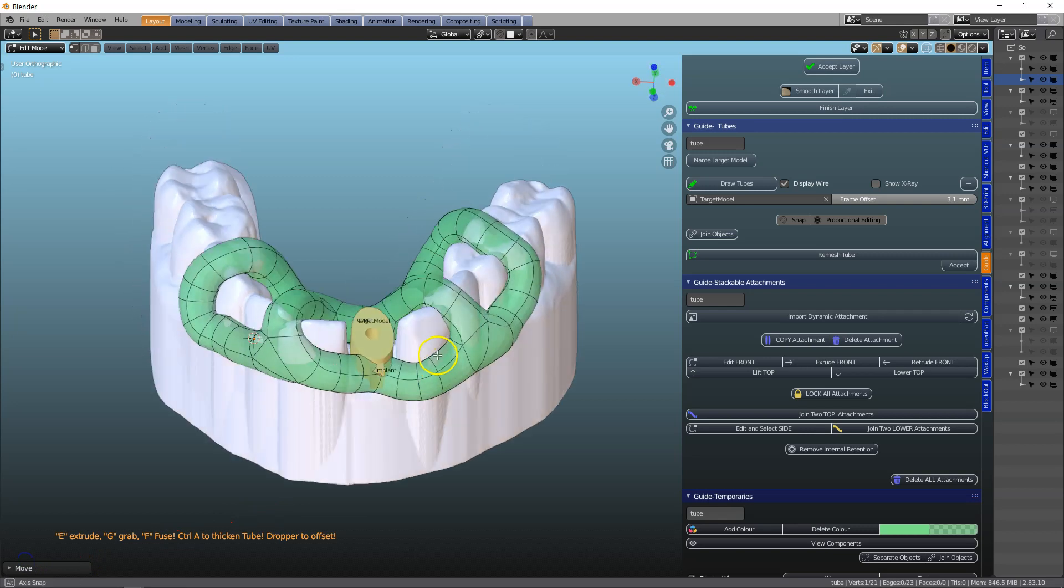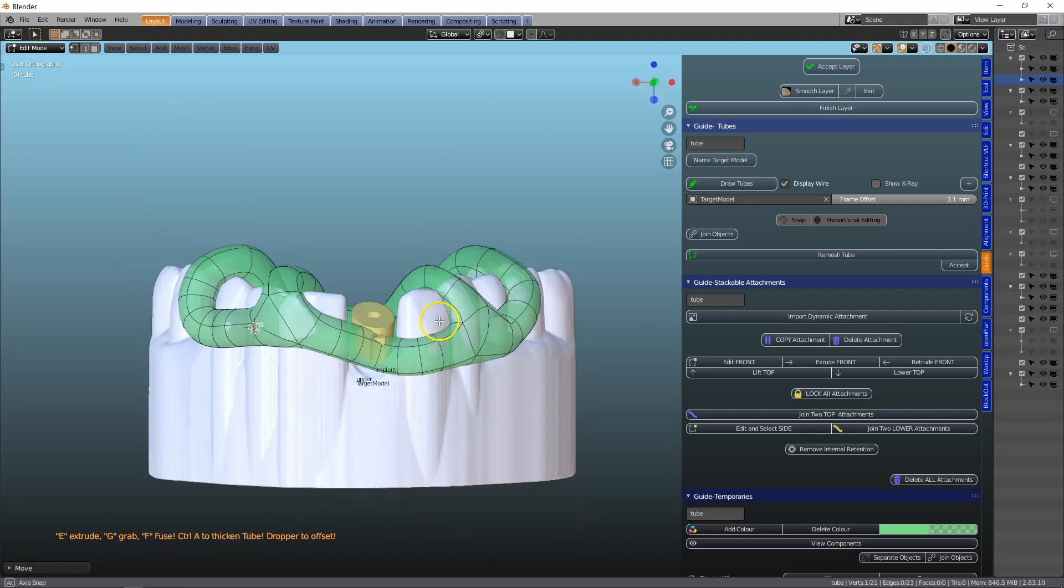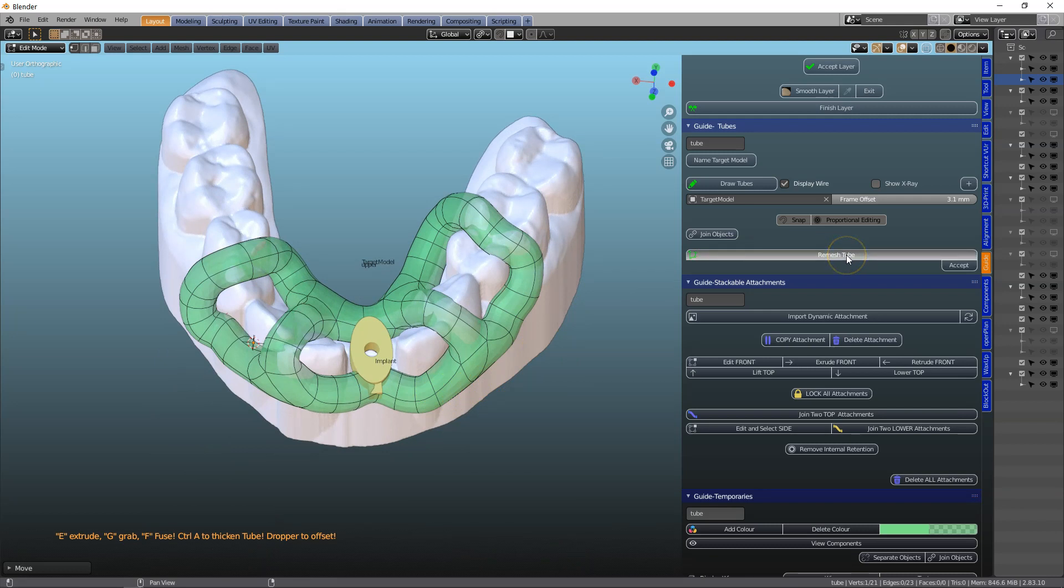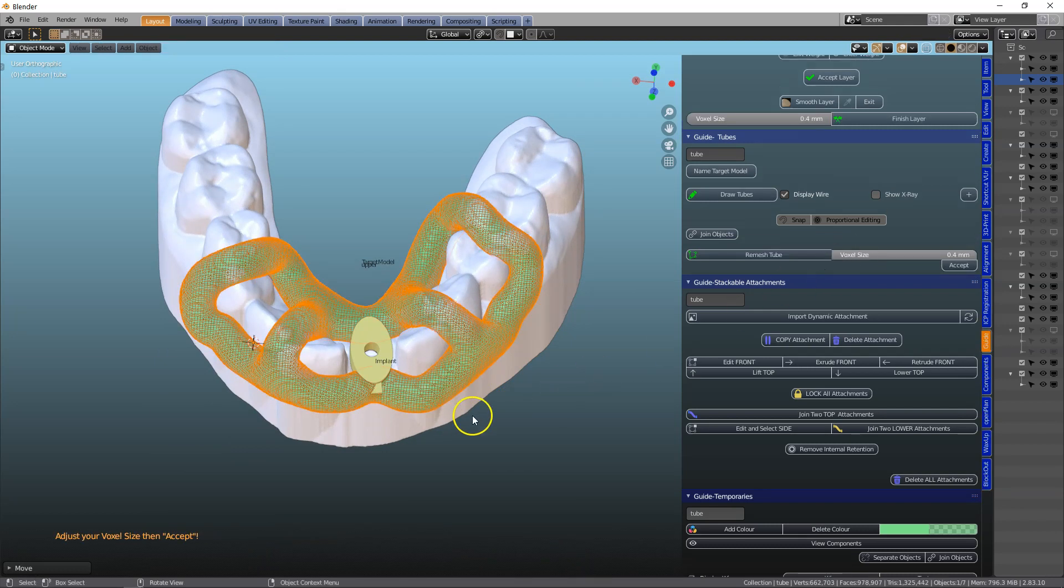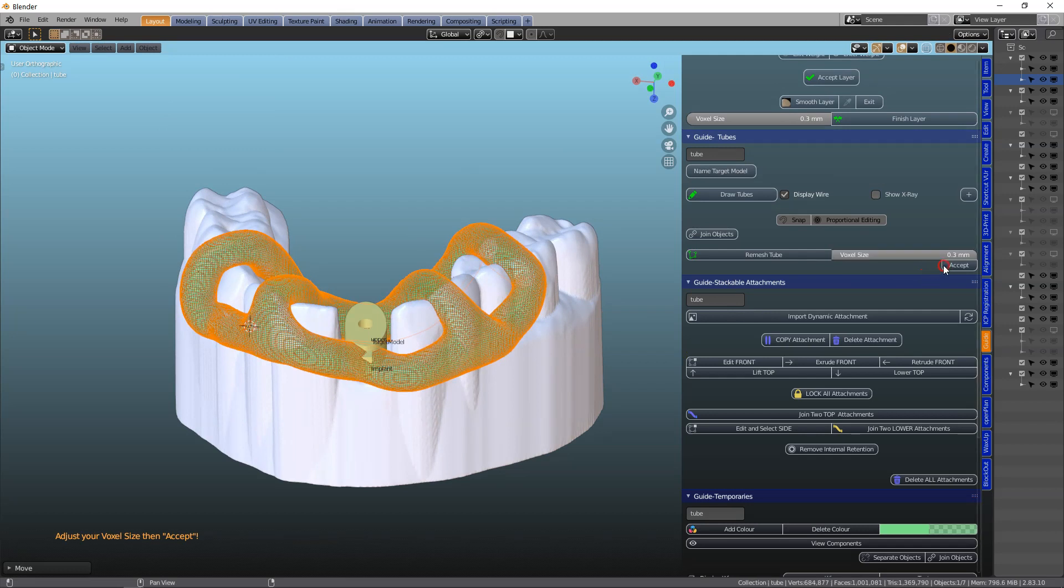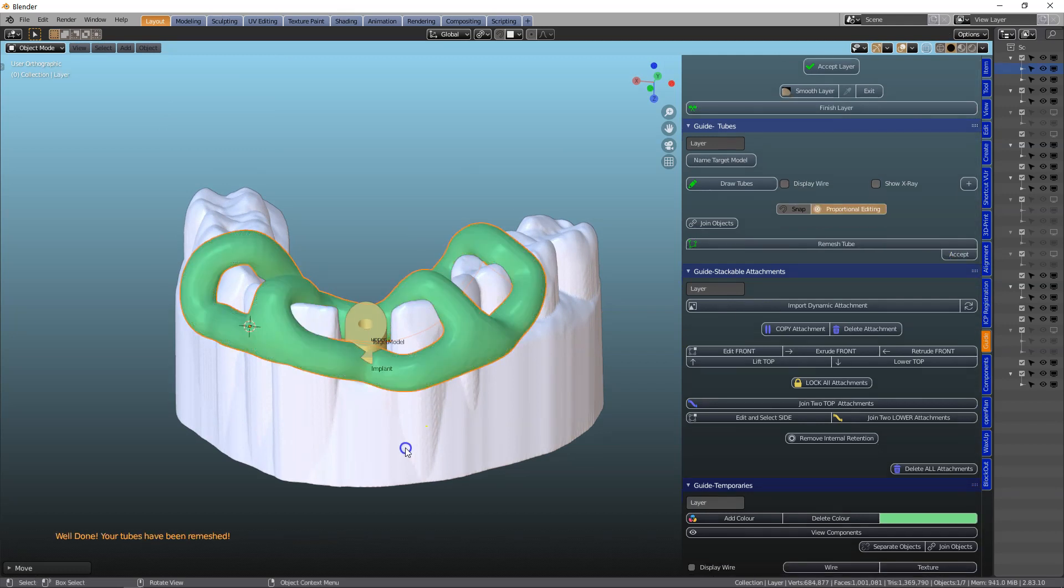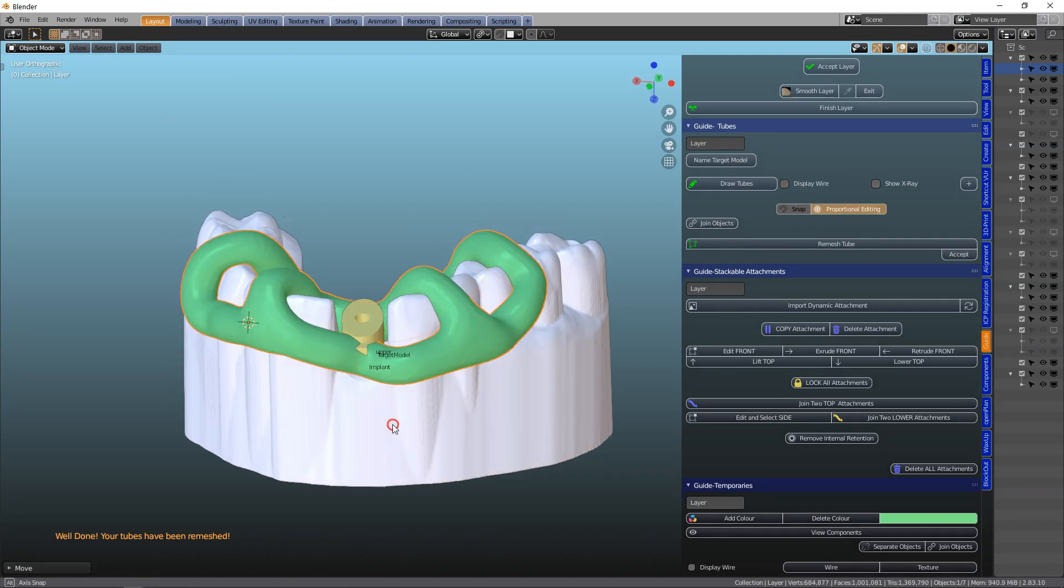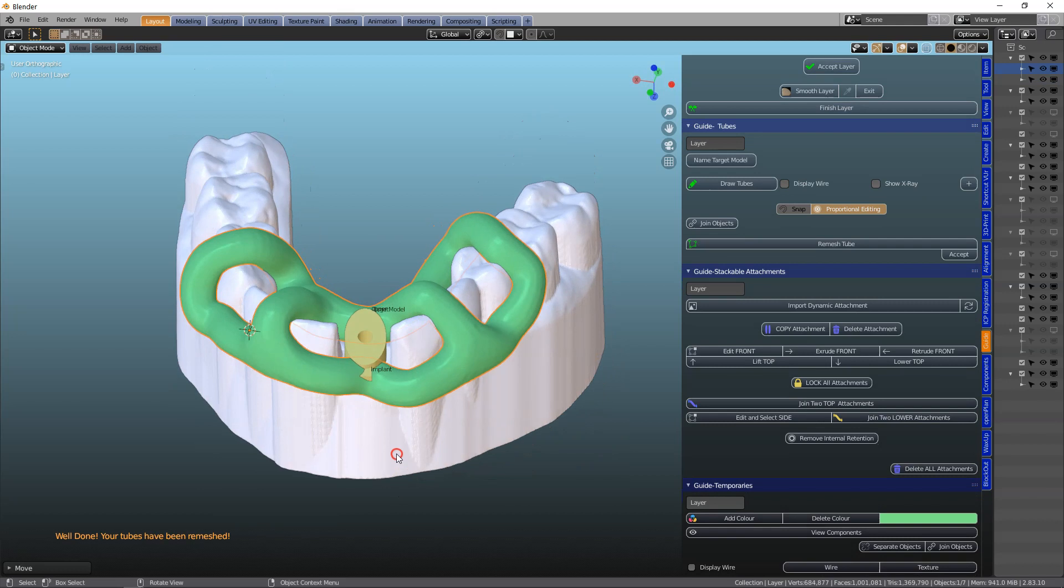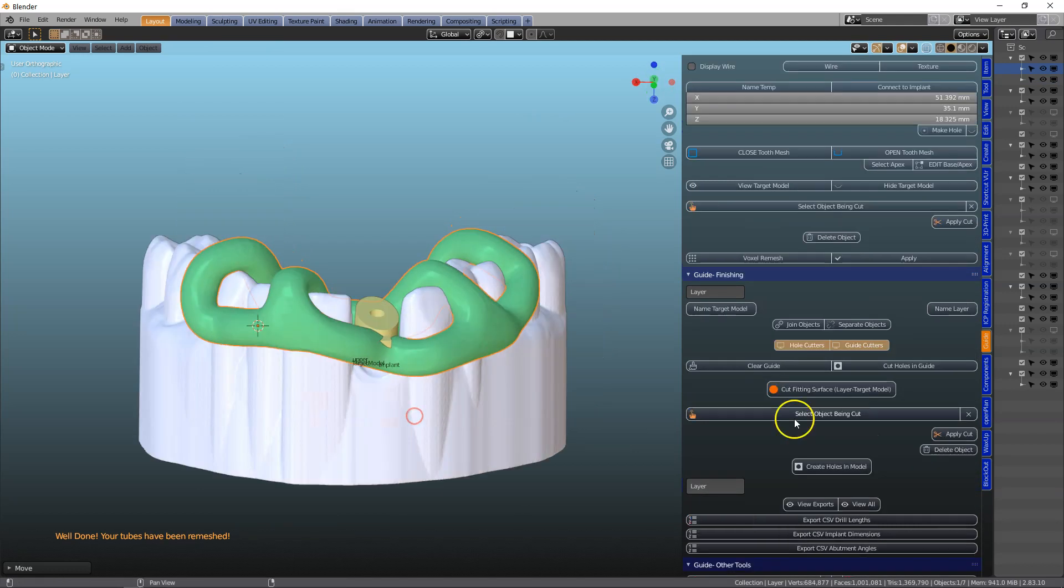So here I've got a proposed design. And we're going to remesh this tube. And we're going to maybe make it a bit finer and accept it. That's looking good. So let us finish this now.